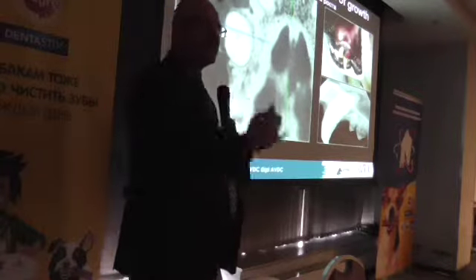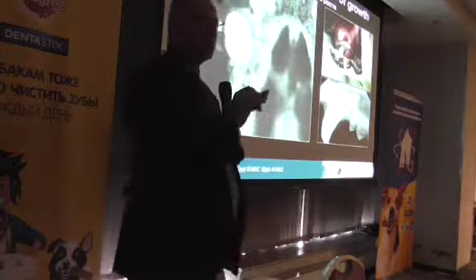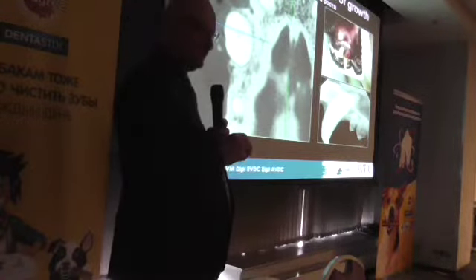Quite often on a 2-dimensional, on a standard radiography, the picture underestimates the size of a tumor.